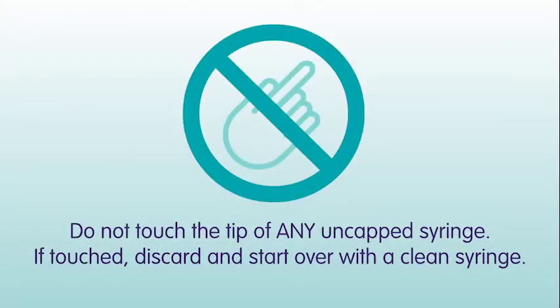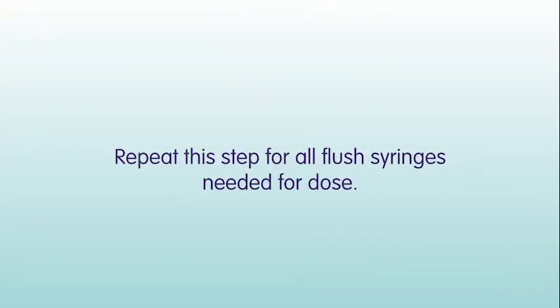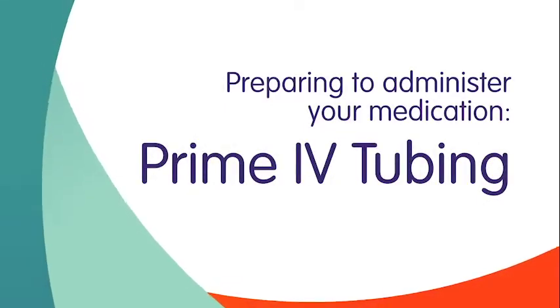Finally, replace the syringe cap, being careful not to touch the tip of the syringe with your hand. If you touch it, you will need to start over with a clean syringe. Set aside the syringes until you are ready to use them. Repeat this step for all flush syringes needed for dose. You are now ready to prime your IV tubing.